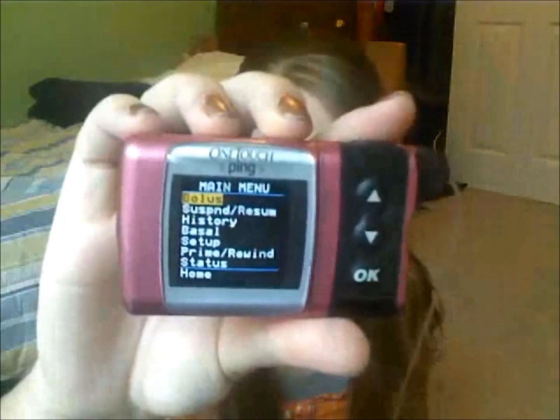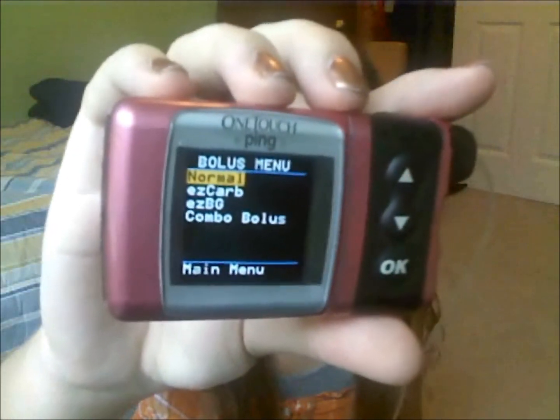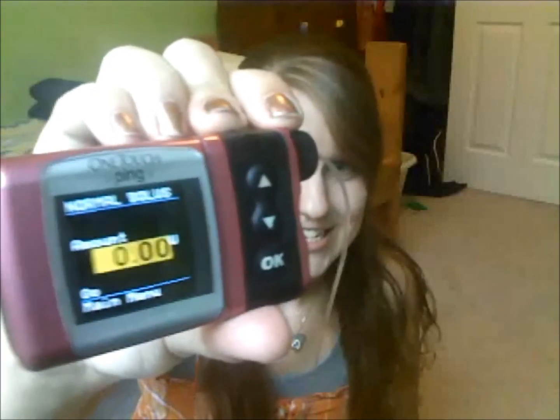So first off, you want to take out your pump, or if you don't have one yet, look at mine, and you basically go to the menu, and the first one on there is bolus. And then it's going to show you these 4 options. So the first one's normal, so we're going to do that, and it looks like this.